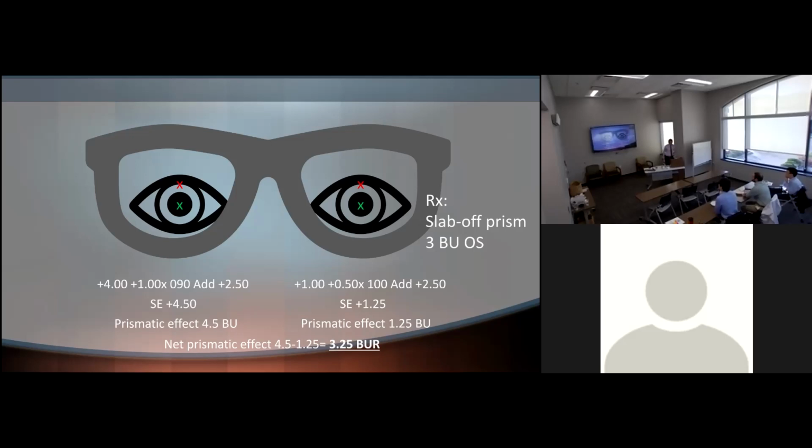So you may have patients who are perfectly ortho, and then when you put them back in glasses they have induced anisometropia with monovision, you may face this problem. So try to be more conservative with this amount of anisometropia. One diopter will be okay, 1.5, but with that amount, 3, it's beyond the amplitude of the patients.